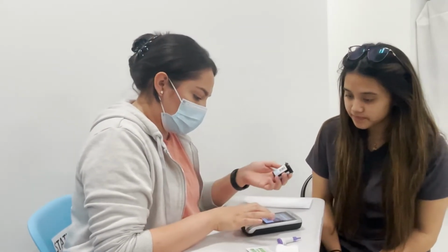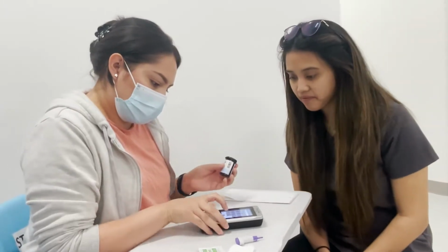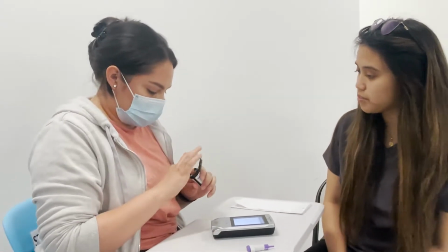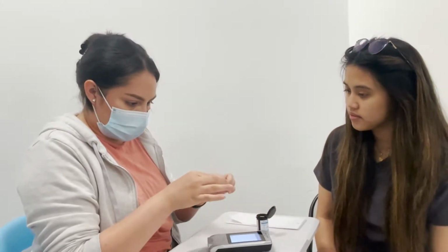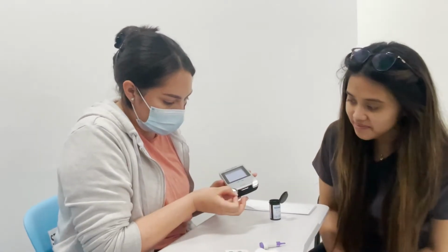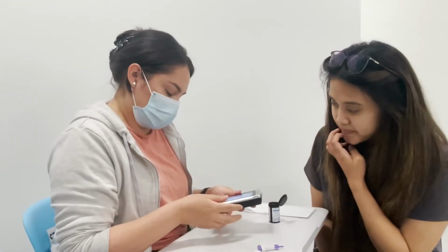Okay, so I want to scan this, right? Yep. Just like that. That's exactly right. And then accept. Beautiful. Okay. And I'll put it in. And then, do you remember which side? I think the gold side. That's right, the gold side goes in. Great job. Perfect. Yeah, you do it so well.